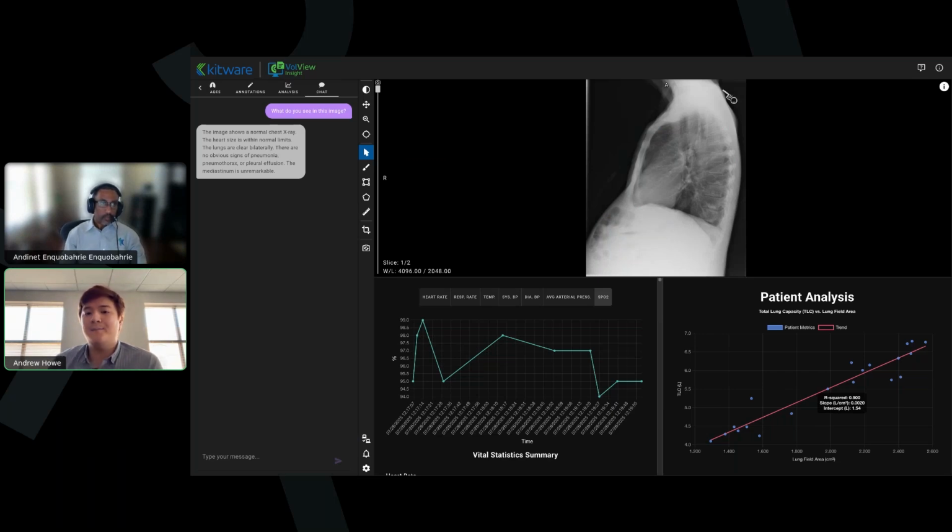And so, again, you might have a proprietary in-house model. You might want to train a model to do something very specific, maybe you want your language model to be used by non-medical people, where the non-medical people or the machine learning people can ask questions because they don't really know about anatomy or physiology. And this doesn't have to be a chest X-ray. This can be an MRI. This can be any sort of imaging data.